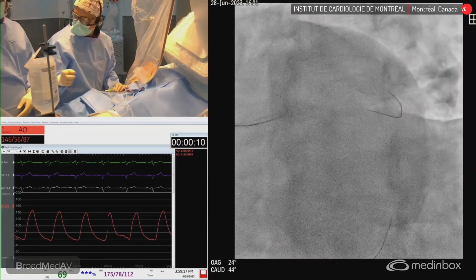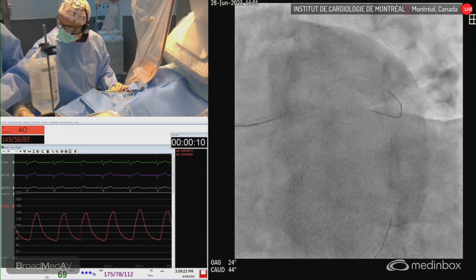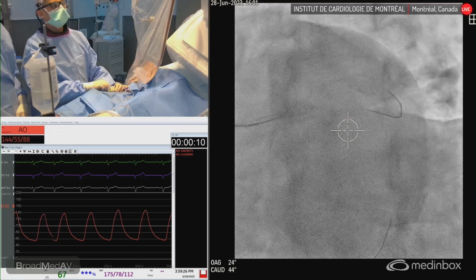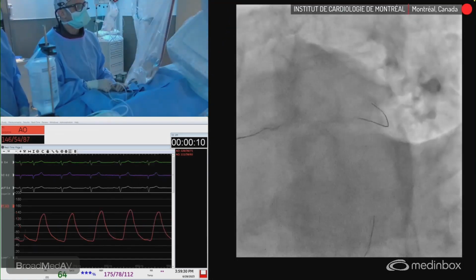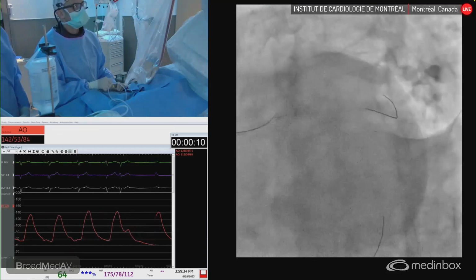Do the roadmap, then the checkmark first. That's a nice feature of the Philips system, the roadmap. It takes you exactly to the place where you were, because it's easier and we don't need to use dye for the secondary.